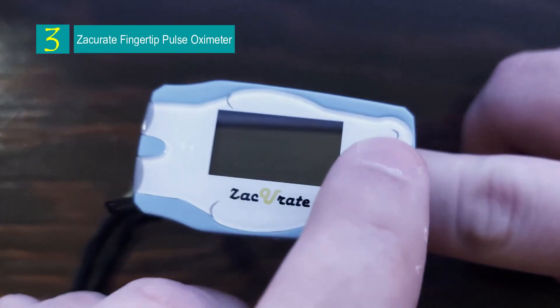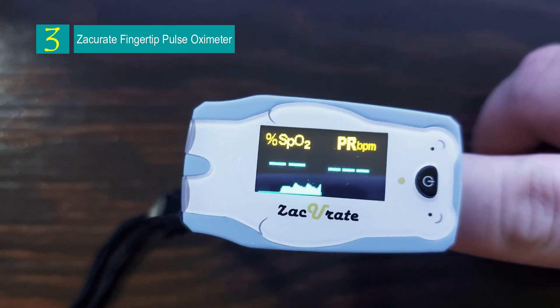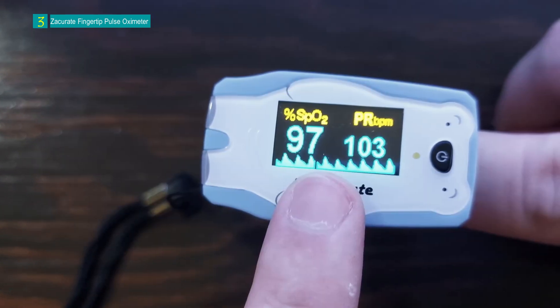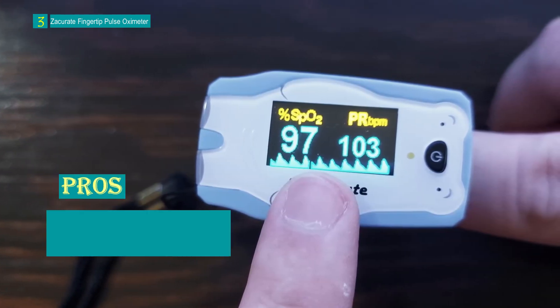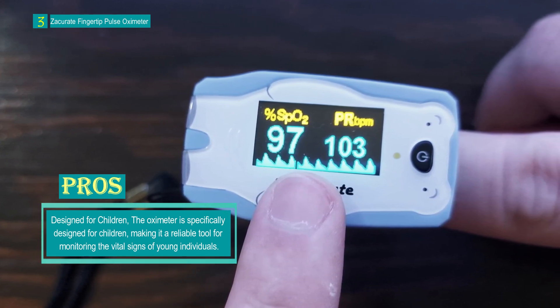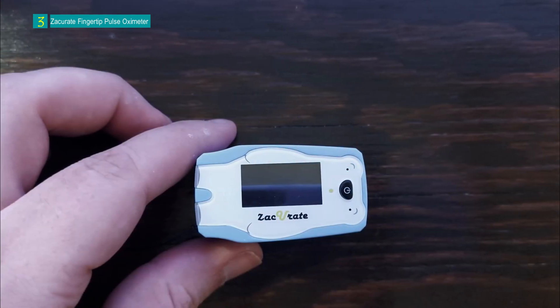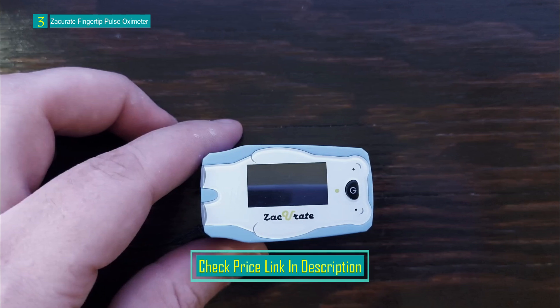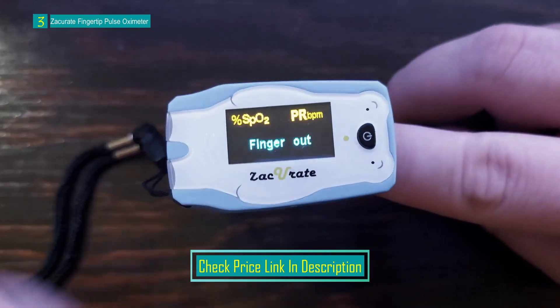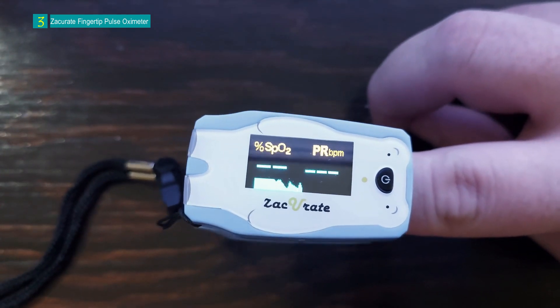Number 3: the Zaccurate Children's Digital Fingertip Pulse Oximeter. This compact and user-friendly device is designed to measure SpO2 blood oxygen saturation levels and pulse rate, specifically crafted for children. It provides a non-invasive and convenient way to monitor vital signs. The device's compact size and portable design make it suitable for on-the-go use, and it can also be used by teens and adults with small fingers. It features an attractive arctic bear blue color with an animal design to make it appealing to children.